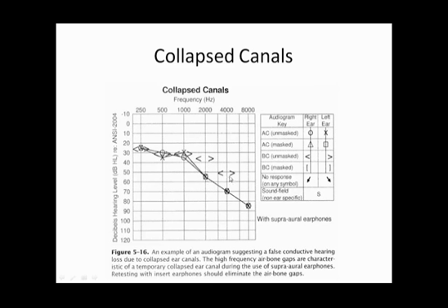So if we tested the patient again, see it says supraoral earphones here. If we tested the patient again with insert phones, most likely these air conduction thresholds would go up. Okay. You would also see this if the patient had occluded ear canals with cerumen. So if the patient is a Q-tip user, you could also see the same type of loss. Or if the patient had an earplug and you didn't bother to check the ear canals before you tested the patient, just put the headphones on the patient with nice foam earplugs on, you could also see this type of conductive high-frequency hearing loss. It is not real.